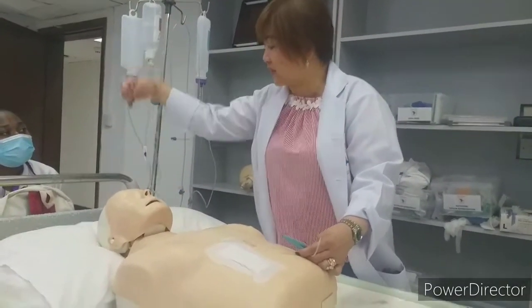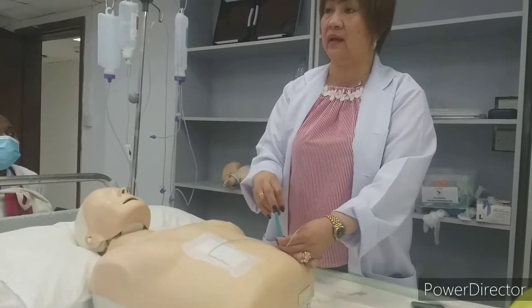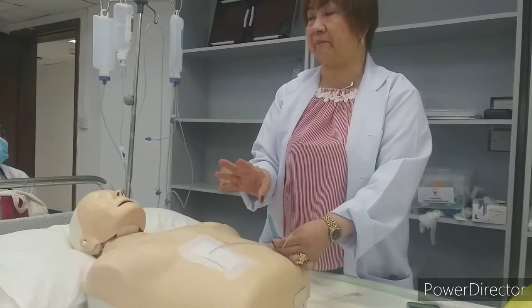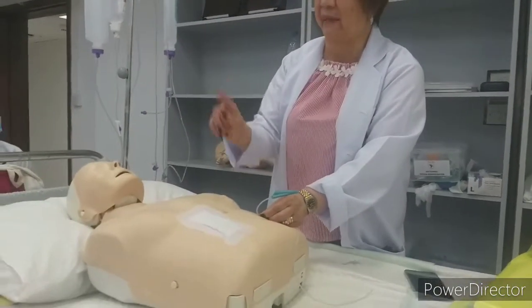So wrap this with your gauze and feed. Same way with the medicine. When giving medication: water, medicine, water. Same. Okay? So once it is here, now what we need to do, same.